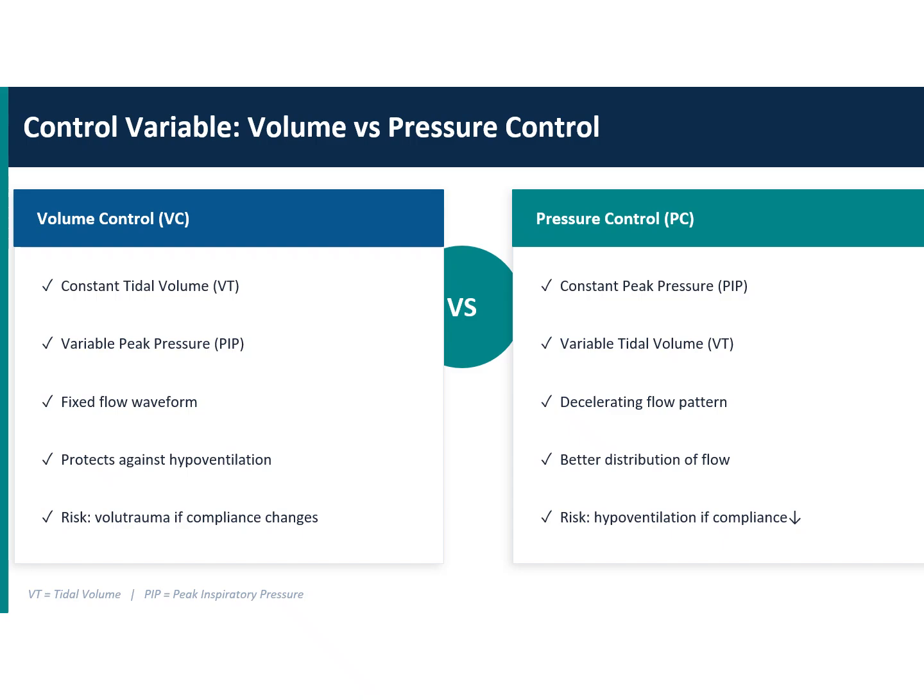So it is not that just because you have set a tidal volume of 400, the ventilator is going to give 400 irrespective of pressure. The moment it reaches the pressure you have set in the alarm, it will not deliver any more. That is the reason why, when you go to the bedside, you see many times that you have set a tidal volume of 360, but patient pressures are going high, so the volumes are not getting delivered. Just because you have put volume control ventilation, it will not burst the lung open, right? So in volume control ventilation, you have a variable peak pressure, which is understandable.